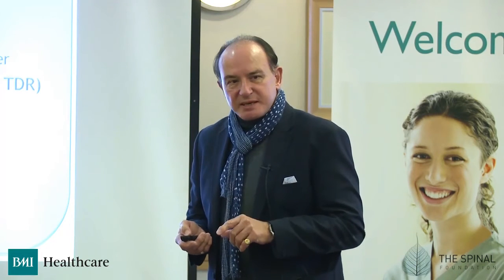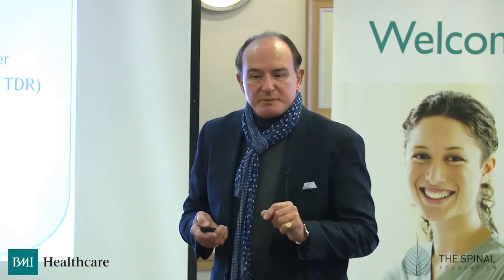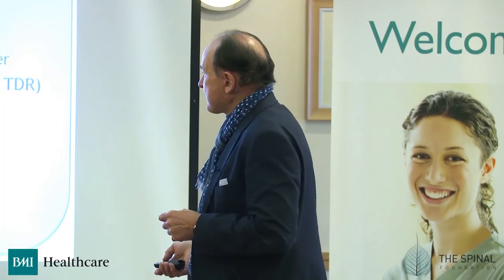But laser discectomy sterilizes the inside of those discs. So maybe that's why laser discectomies have been useful for all these years. And there are hundreds of thousands of patients now around the world who've had laser discectomies.